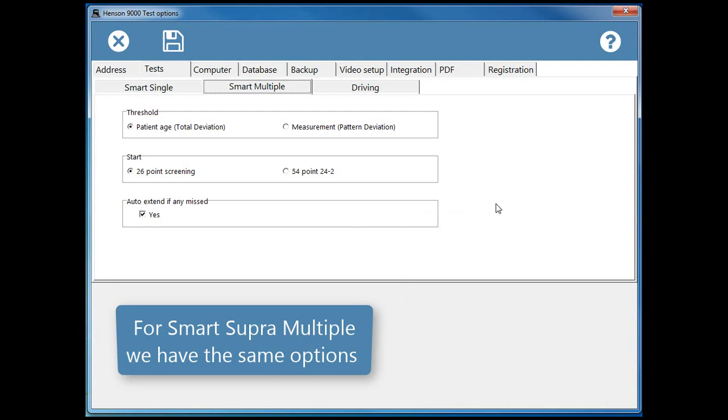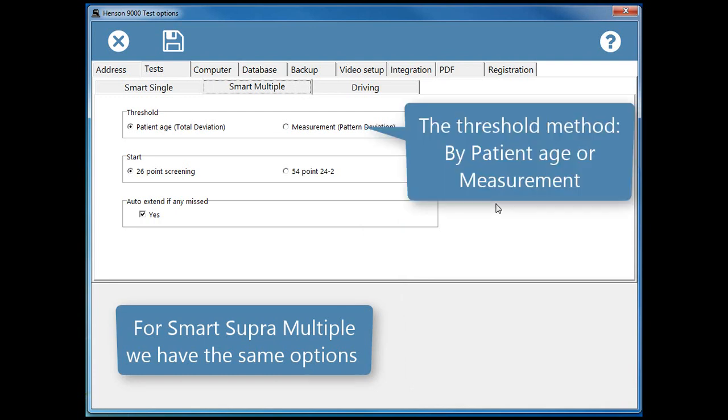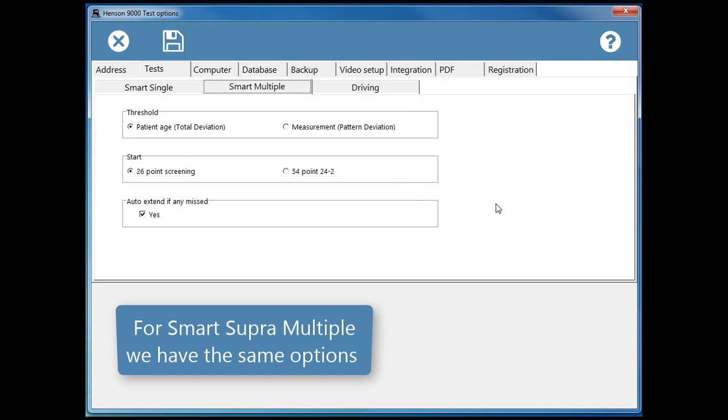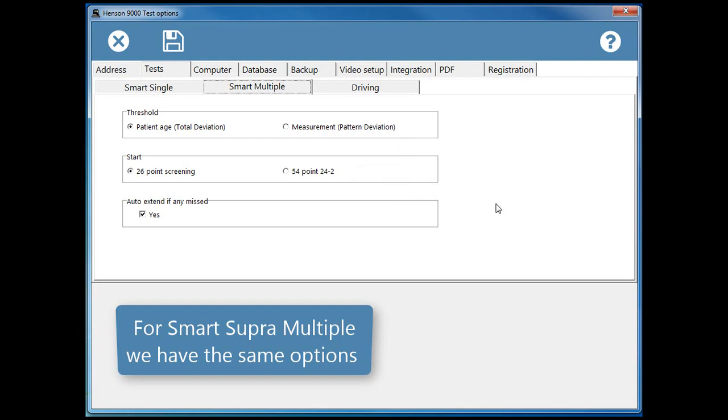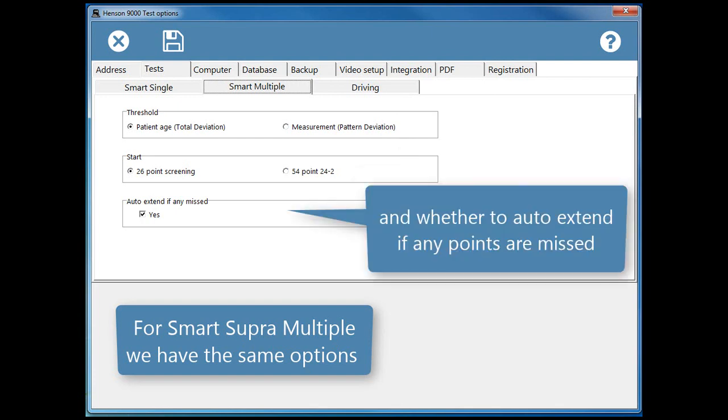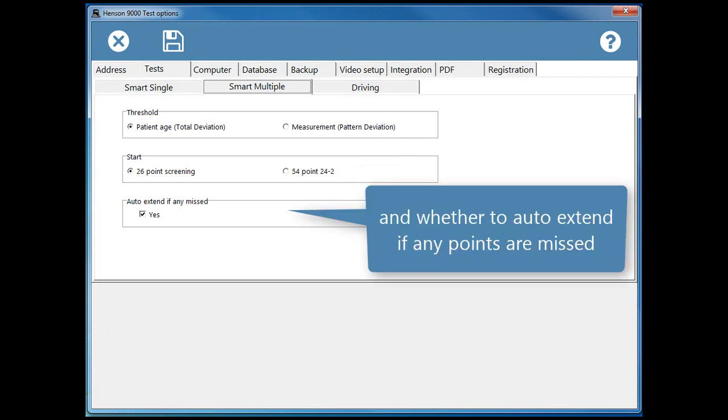For Smart Supra Multiple we have the same options. The Threshold method, by patient age or measurement, the Start level, screen or 24-2, and whether to auto-extend if any points are missed.